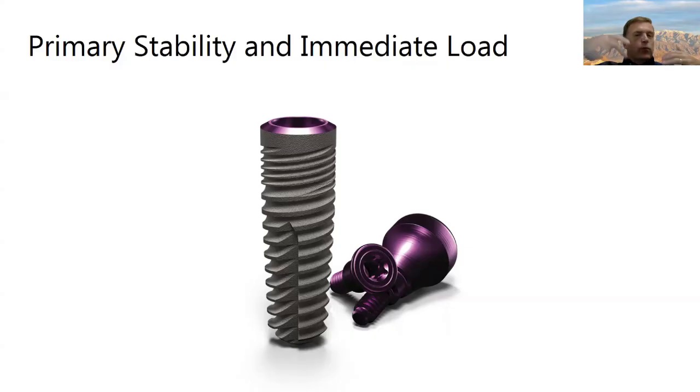Like our provisionalists, it's their first experience of what we're doing for them, and we don't want a massive disappointment at that point. So successful immediate loading has a few things. It's helpful to pick an implant that is contoured to create primary stability. Drilling protocol, for those of you that place implants, is super critical. Most of the time there's a manufacturer drill sequence, but you need to use your experience to say, I might stop 2 drills early on this one to make sure I get good stability.